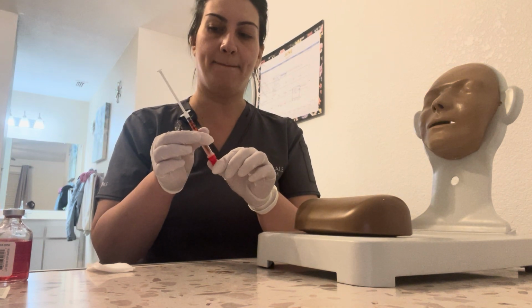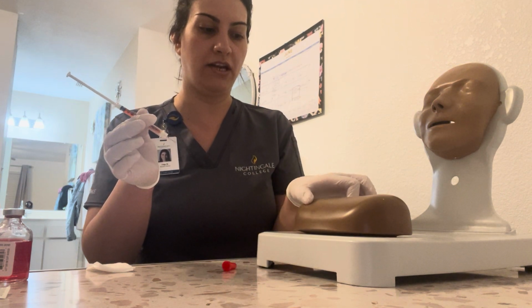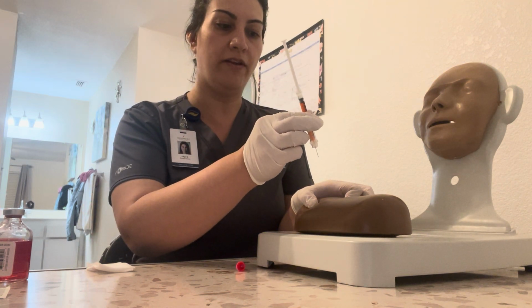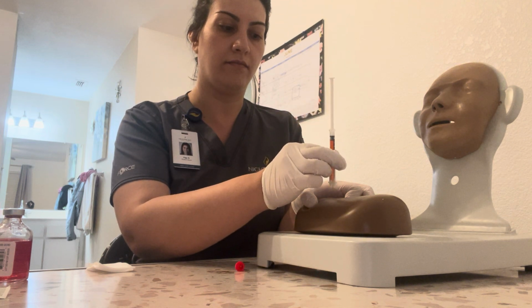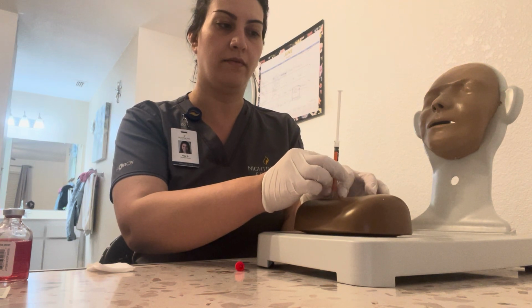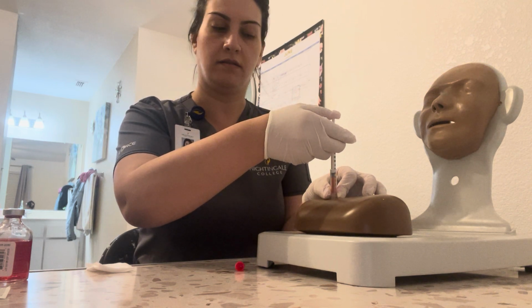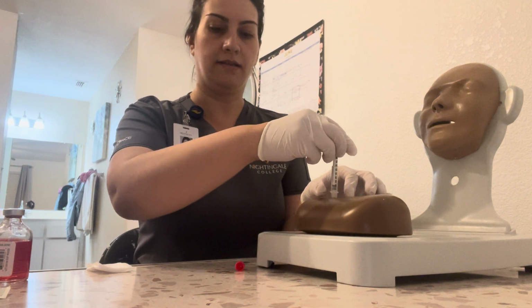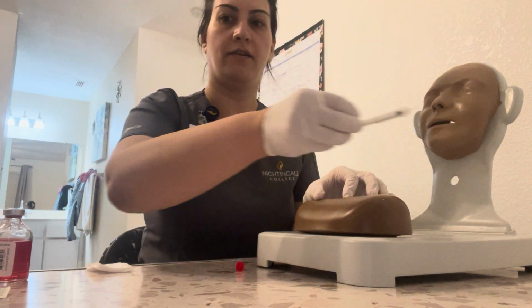We're going to take off the cap. We're going to go ahead and pinch here with non-dominant hand, dominant hand. We're going to go at a 45 to 90 degree as a dart quickly. I'm going to release that pinch, grab it over here, dominant hand. We're going to inject. We're going to slowly take it out. We're going to put this in the sharps container immediately.